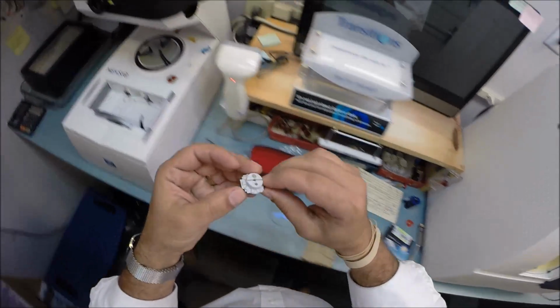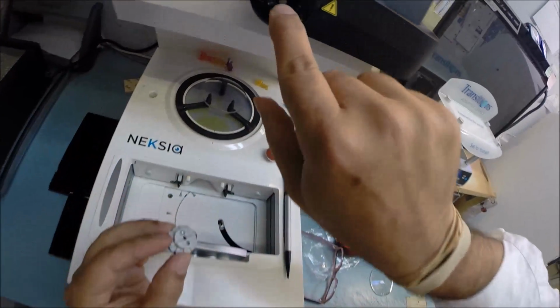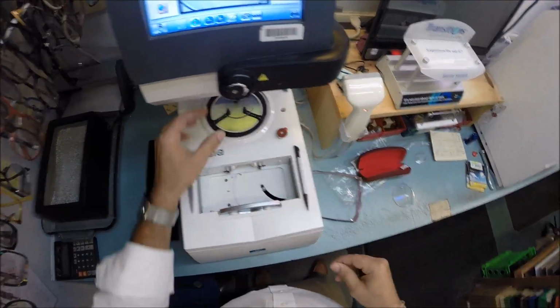So I'm going to pull that sticker away to make the black side sticky. Line up that magnet. That little silver button is a magnet. It's going to attach itself to something magnetic. In fact, why don't you go look that up? What type of metal is magnetic?